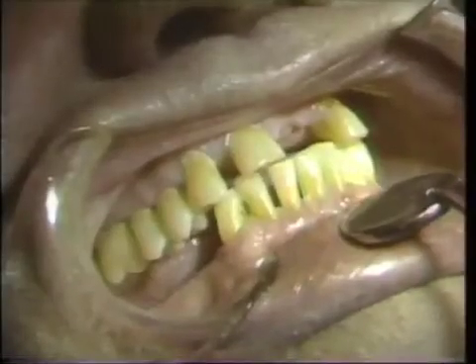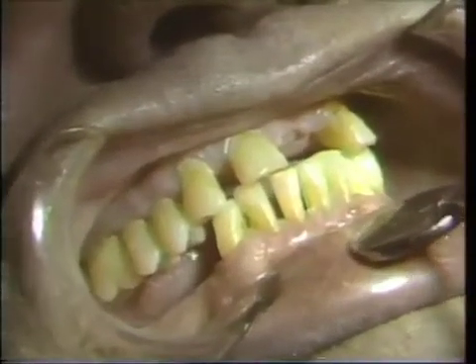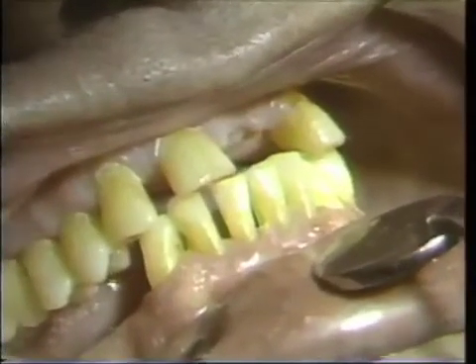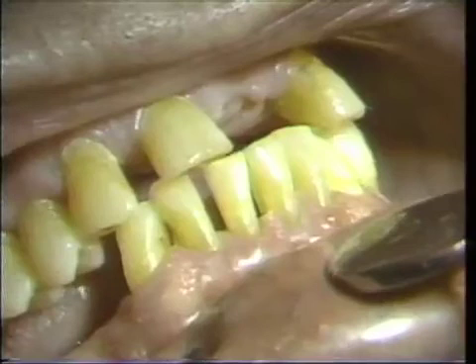The completion of the hygienic phase — still two weeks on the right side and three weeks on the left side.